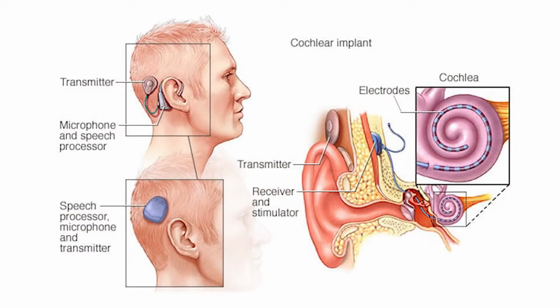This is very important. Cochlear implantation, as I told you, involves surgery. We are talking about two components. One of the components is put behind the ear, in an incision made behind the ear during surgery, and the implant is fixed under the skin, attached to the bone.